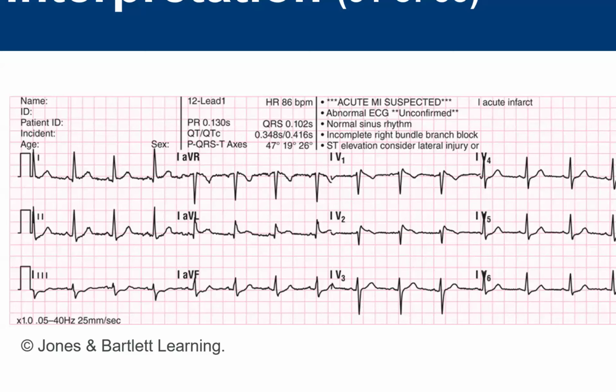Yes, you can call it. We don't diagnose heart attacks. We confirm a STEMI. We call in the STEMI, we activate the STEMI team. They come in with their wires, scope, check the heart, cath the heart. They diagnose the MI because doctors diagnose. Which is fine. We just point it out. Alright, we're like, hey, this is bad, doc, and this is what it probably is, and you get to say yes.